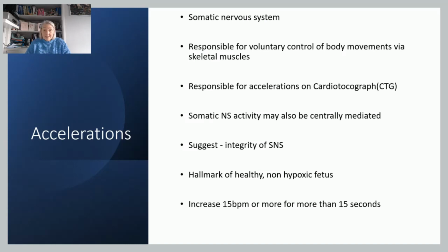The somatic nervous system may also be centrally mediated. So if you've got accelerations, it's suggesting that you've got a well-developed central somatic nervous system. So it kind of shows you the integrity of that somatic nervous system. Accelerations are hallmarks of healthy, non-hypoxic fetuses.